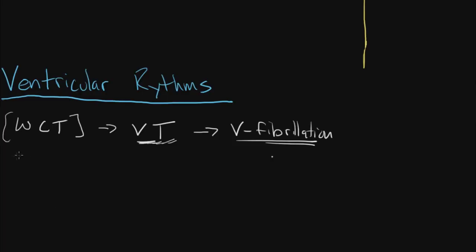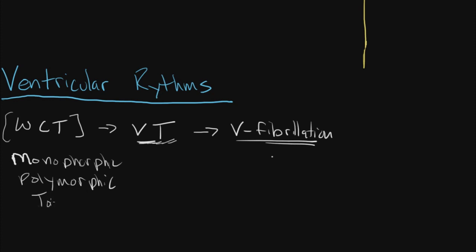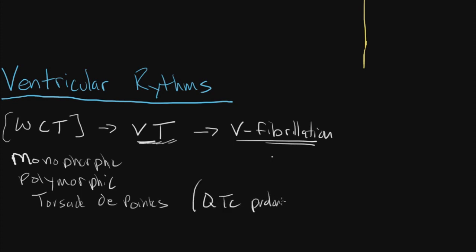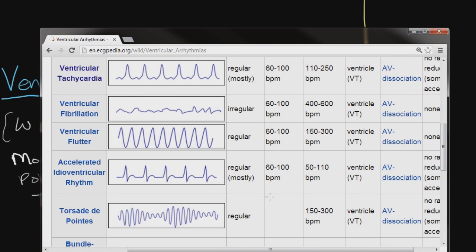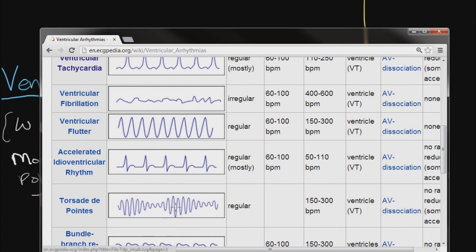It's important to know that ventricular tachycardia rhythms can take different appearances. You can have monomorphic ventricular tachycardia or polymorphic. There's a specific type known as torsades de pointes, which is a twisting phenomenon that usually comes from QTc prolongation. QTc prolongation is a very common side effect from numerous drugs, electrolyte abnormalities, and CNS problems. Examples here compare those rhythms: at the top you have ventricular tachycardia, then ventricular fibrillation, ventricular flutter, accelerated idioventricular rhythm, and torsades de pointes associated with QTc prolongation.